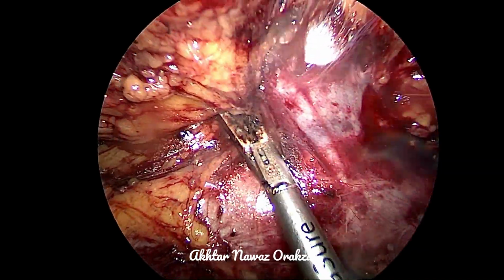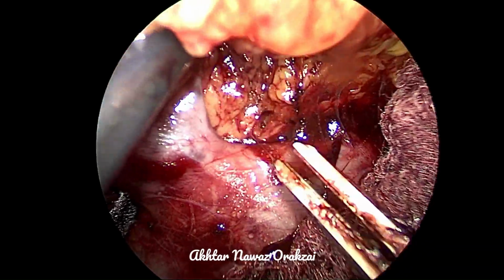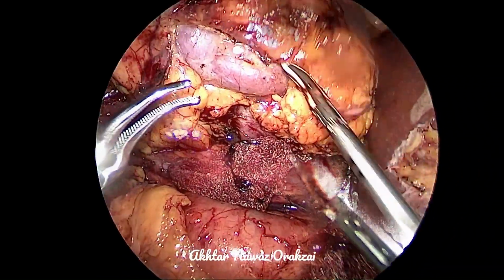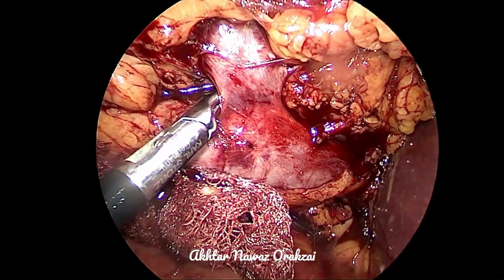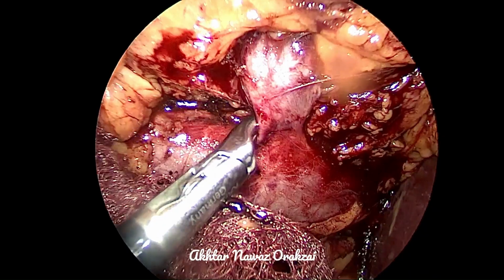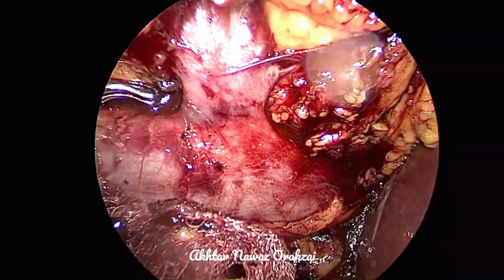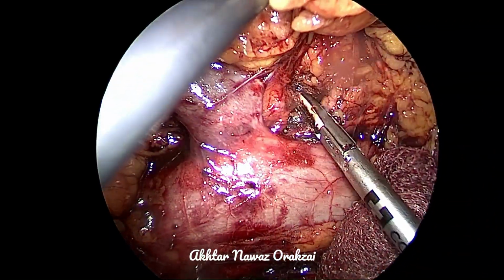I'm saying this because with the retraction and changing positions of the kidney, the artery can go a little superior or inferior, leading to a change in the original position. So the artery is posterior superior, and it is having an inflammatory lymphatic reaction, so it has to be separated from the vein. The vein seems to be really short, so we are worried about how we'll apply clips on the vein.